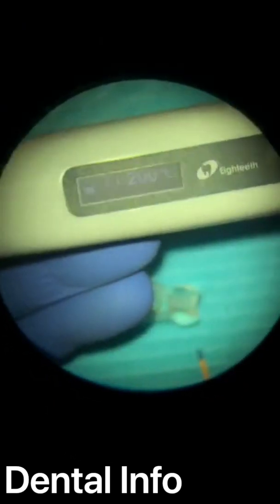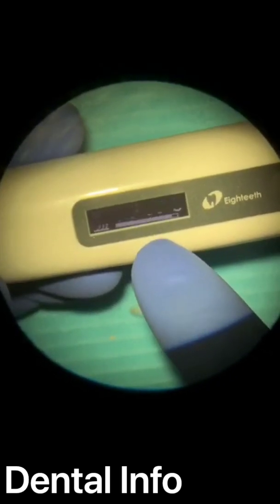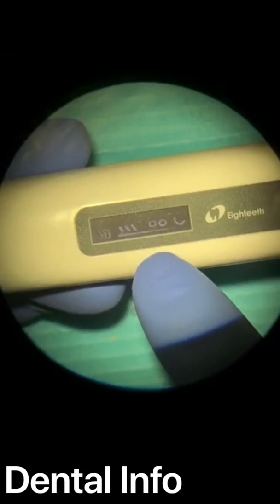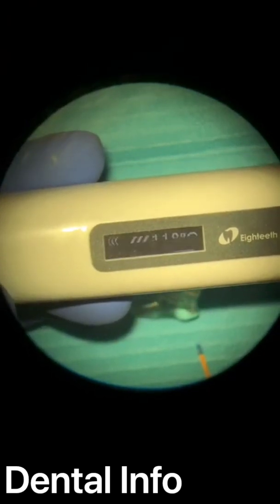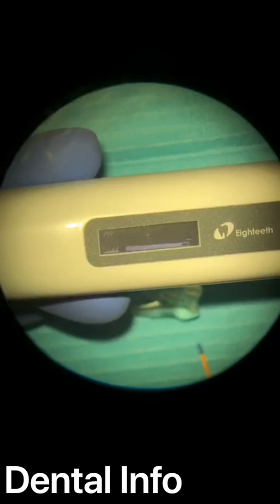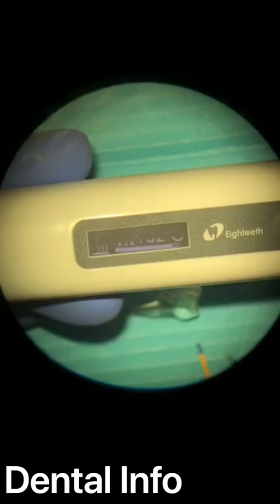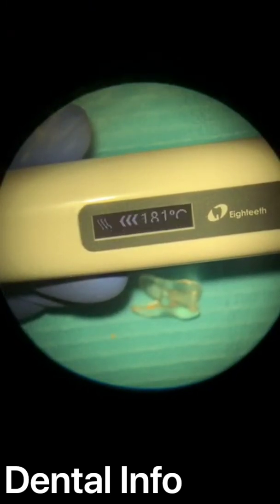Okay, so the device now is not heated yet, it's cold, so let's heat it up. We press this button, and the device in less than 30 seconds will reach the temperature that I requested. So in less than 30 seconds, we will reach 200 degrees. I recommend high temperature because it's easy to manipulate when you have a very warm gutta percha. It's easy to condensate and manipulate. So we are waiting, we are waiting.